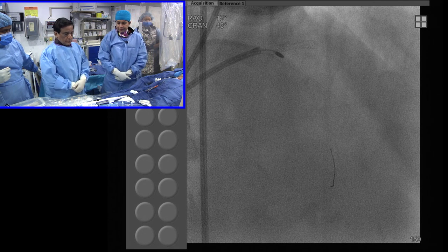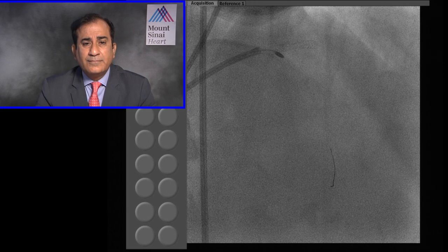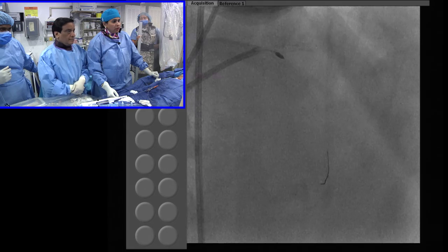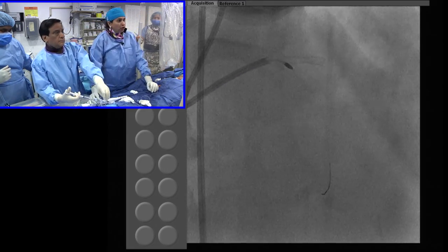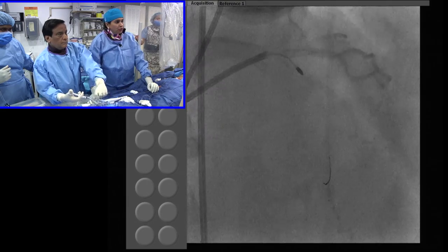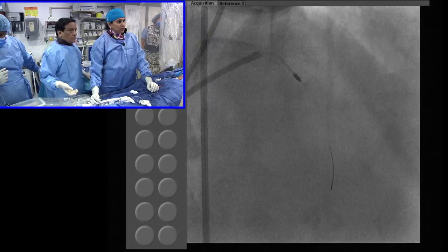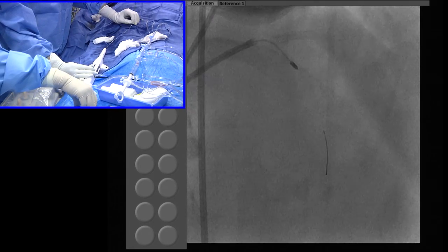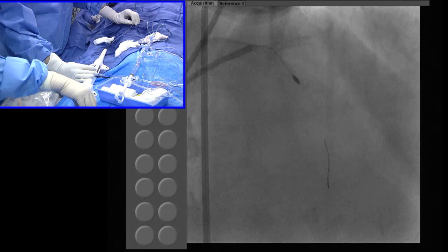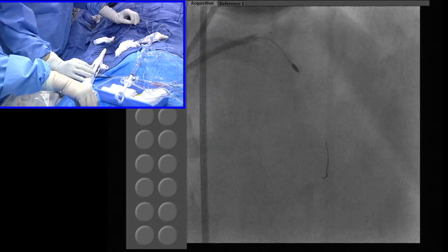Several of these dissections you could not see angiographically. No, you will not see them angiographically. Another important point is that if you're not seeing it angiographically, that does not mean it isn't there. You have to do 2 views, and in the 2 views, if you don't see it, then go ahead and leave it. All excellent points, realignments which we have to make in our techniques for BVS, but very important points.